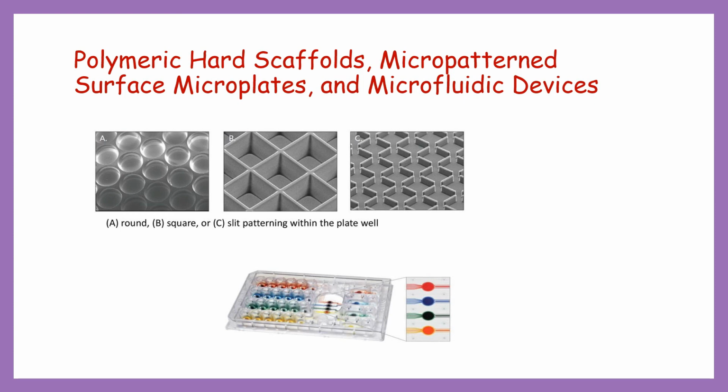Currently, the most common applications for such scaffolds are for tissue regeneration, recreating the natural physical and structural environment of bone, ligaments, and cartilage for skin, vascular, skeletal muscles, or CNS tissue, and for preclinical in vitro 3D culture testing for tumoroids or engineered tissues, like organoids.